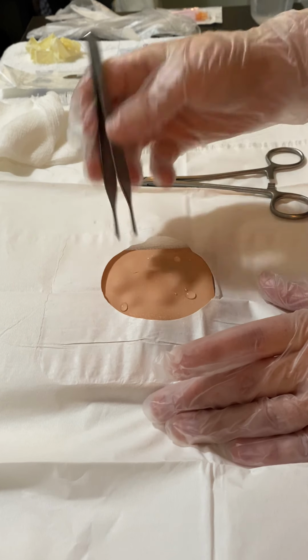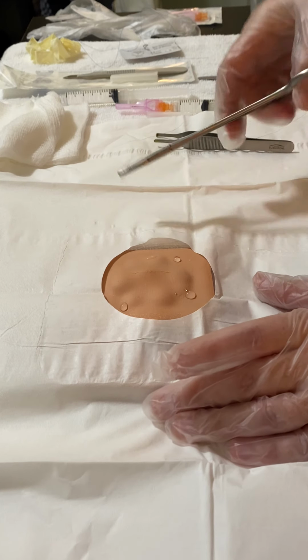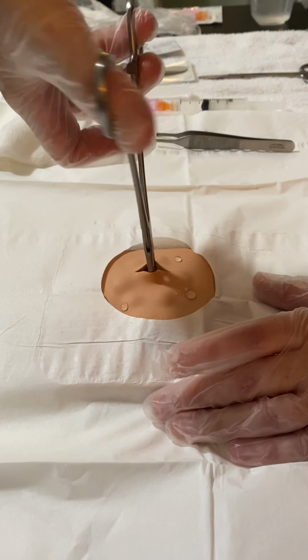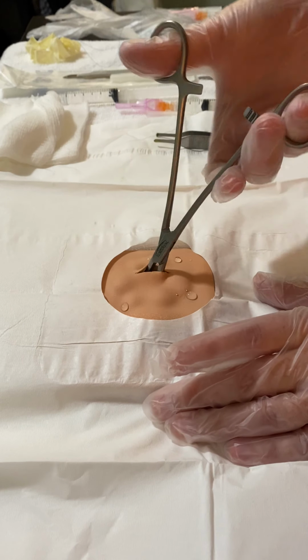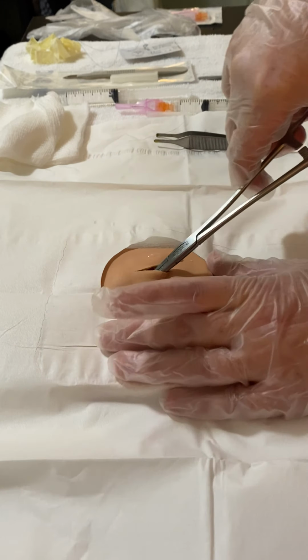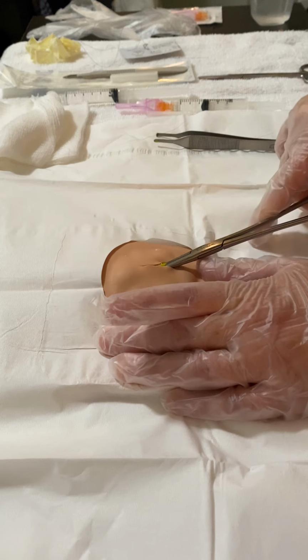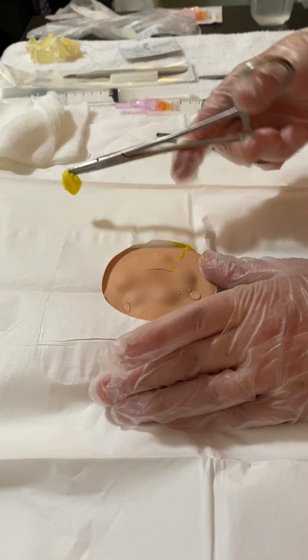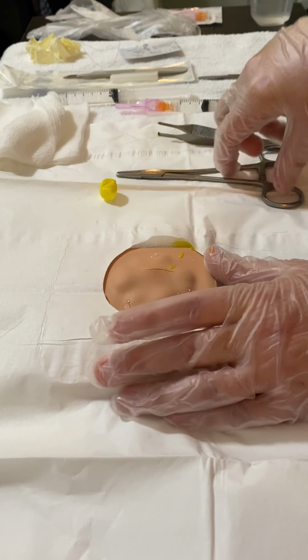So I could just use these instruments to break up any adhesions, and then remove the sac of the cyst.